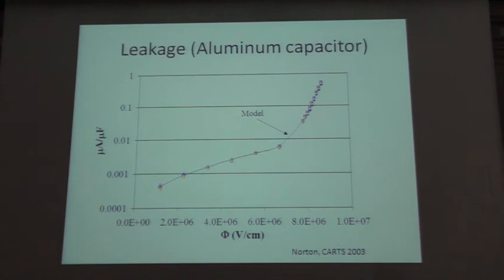And so we have a good sense of what leakage our devices are going to give us, normalized by capacitance, since it's going to matter how big the device is. This has two consequences that are important for the design. The first is that no matter how far down you go, the leakage is still high compared to what you would need to keep the device charged. This therapy might not happen for months. And so if you kept the capacitor charged and ready, the leakage would drain your battery pretty quickly. That's unfortunate. Since you've only got 14 seconds before you want to operate, that means you need a circuit and a high rate battery that can charge it. But it turns out that pretty much everybody's been able to do that without too much trouble. So it's not a serious problem. It's a minor disappointment.